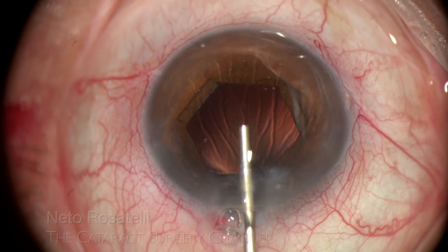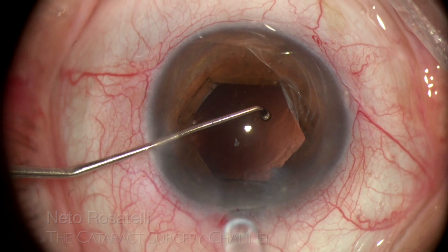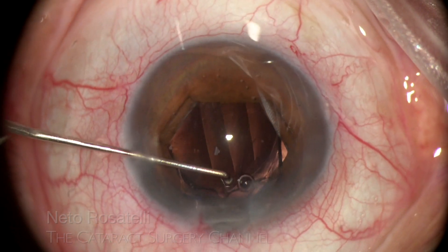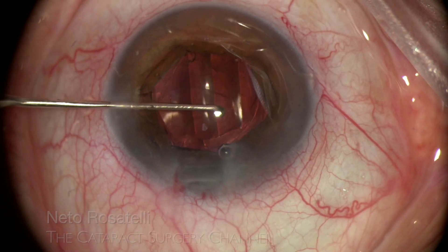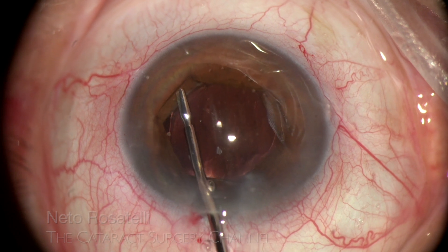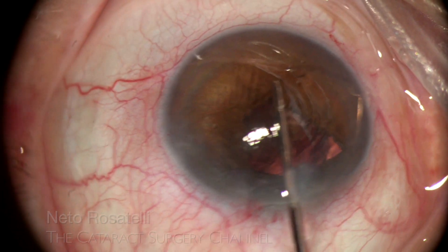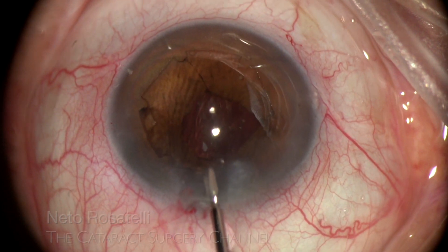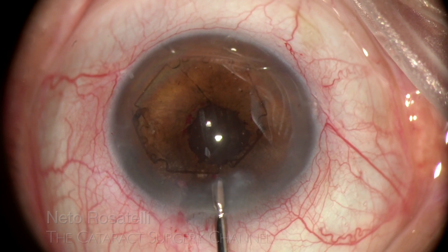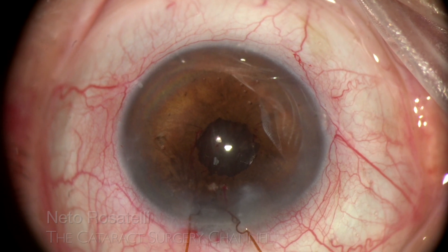The eye is filled with OVD again to allow for IOL implantation, easily done with the B-hex still in place. The B-hex is then easily disengaged from the pupil and removed from the eye — what a wonderful device, very effective and easy to use, completely unobtrusive. I love it!